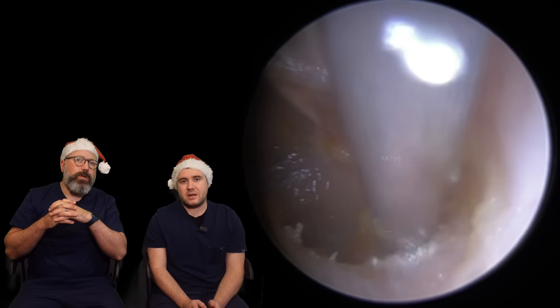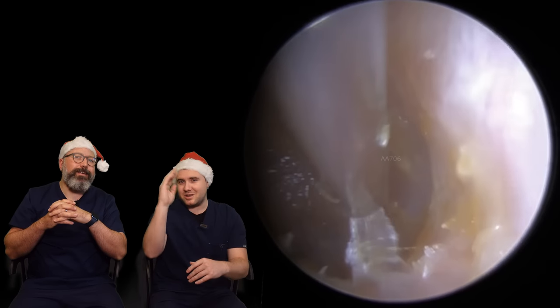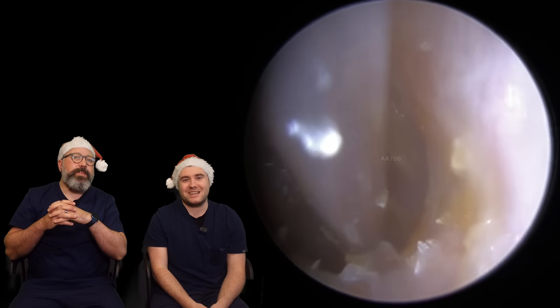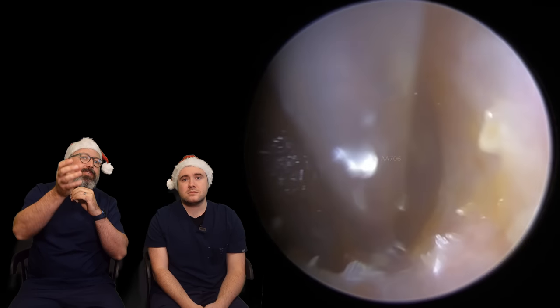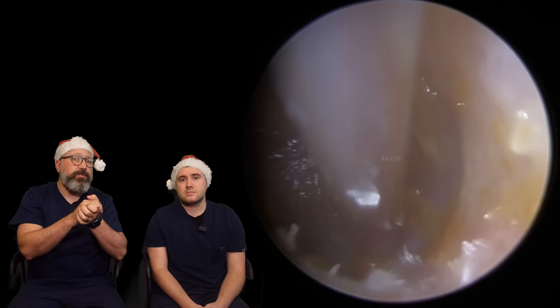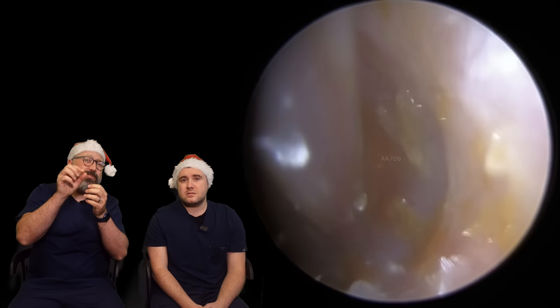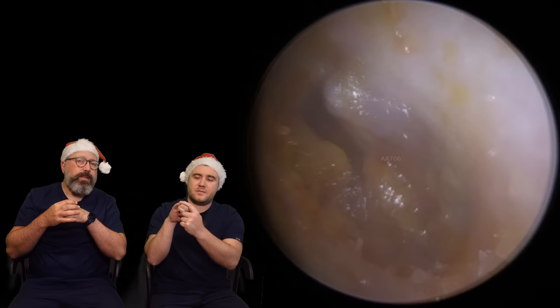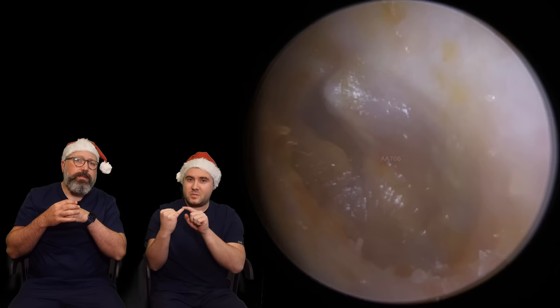It's not as easy as it looks. We do get a lot of people commenting and saying, why didn't you go in there and just take that off? But it really is not easy. With this depth of ear canal, these canal walls are so sensitive and so thin. The size of the fine end — the tube you can see on it at the moment — is just over a millimetre, about 1.5 millimetres. So it gives you an appreciation for how small these little bits are in there. We're talking about a space about the size of the tip of your little finger — that's the space we're working in.